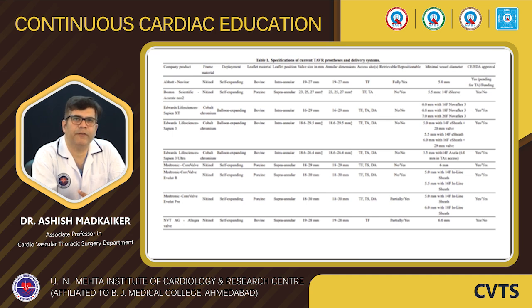Some of them are only for transfemoral, some are for all approaches. Some of them can be retrieved and repositioned. Some of them cannot be repositioned. And interesting to note is the vessel diameter requirement. If we see the newer ones, we can now conduct these procedures even with a vessel size of like 5 millimeters. So that much advancement is happening now in terms of the delivery devices of these valves.